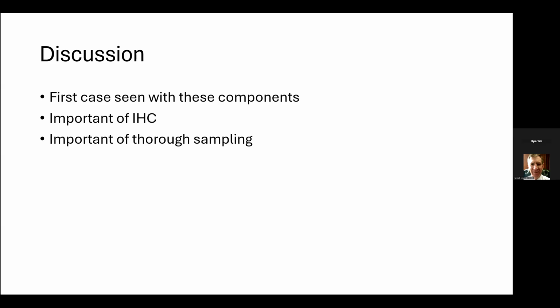But seeing this with the thyroid follicular part in the macroscopic appearance, and also seeing the other component of a dermoid cyst, and then putting it all together, and seeing the other part with these round blue cells clustering in one area, actually encouraged me to present this case. And also looking at the importance of having immunohistochemistry in helping to solve some of these problems that may arise.